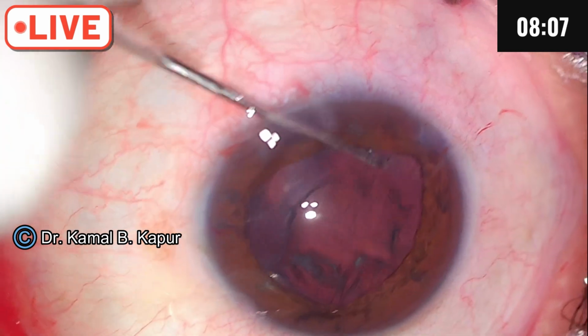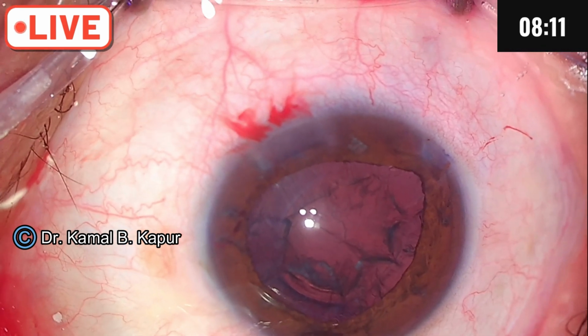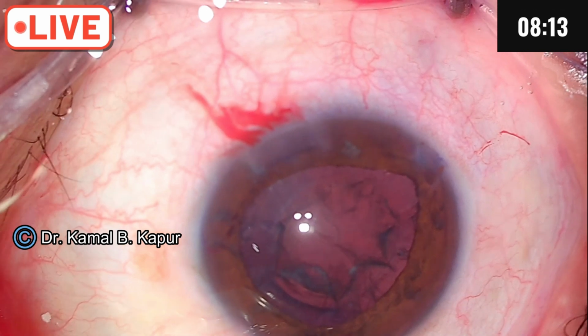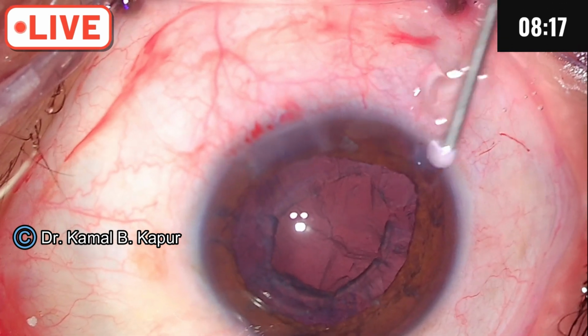Go and tilt your Sinsky. There. Hopefully we are in business.